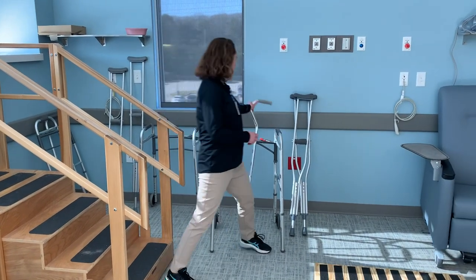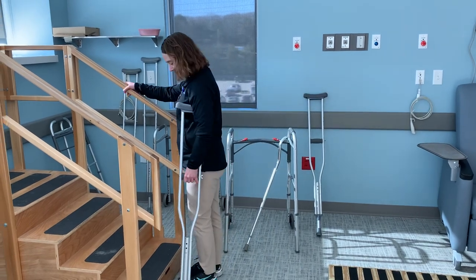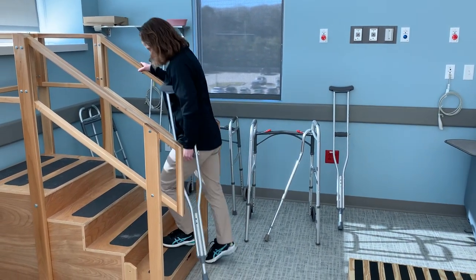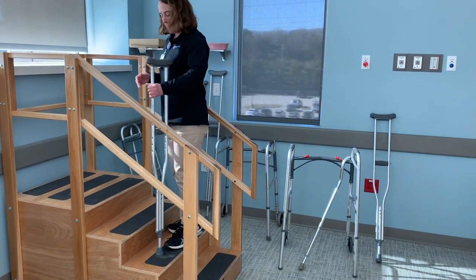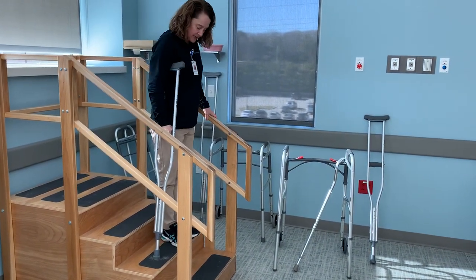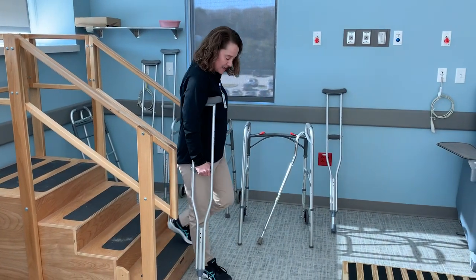You can also use a crutch to go up the stairs with one railing. You'll still always go up with that good leg. And you'll go down with the bad leg — crutch first, then bad leg.